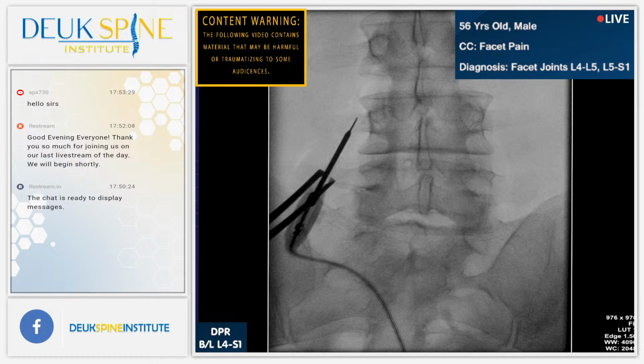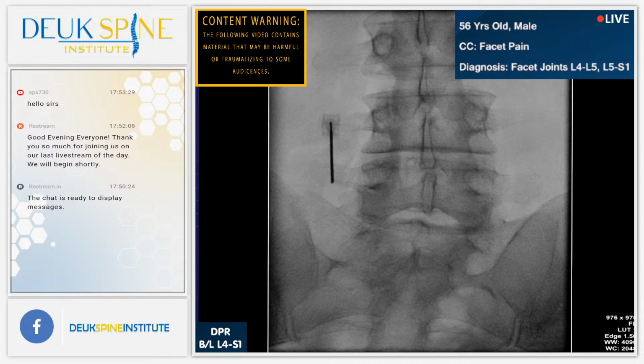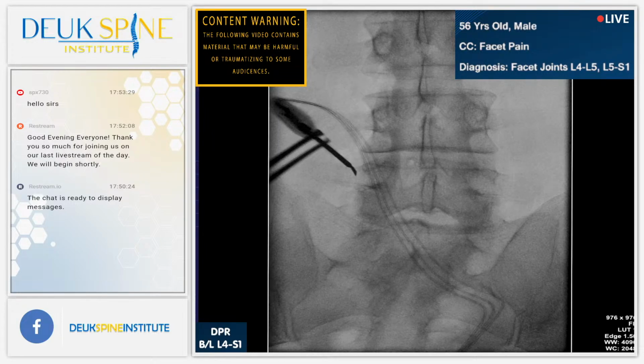The nerve we're trying to cut through is called the medial branch of the dorsal ramus. This happens to be a small nerve that comes out of the spine, right where the nerve root comes out, and it goes to the facet joint. Its whole purpose is to give feeling to the facet joint. If you have pain in your facet joint, you're going to feel the pain because that nerve is there. So doctors figured out a long time ago that you could destroy that nerve and eliminate a lot of people's back pain, at least the people that have pain from their facet joint.